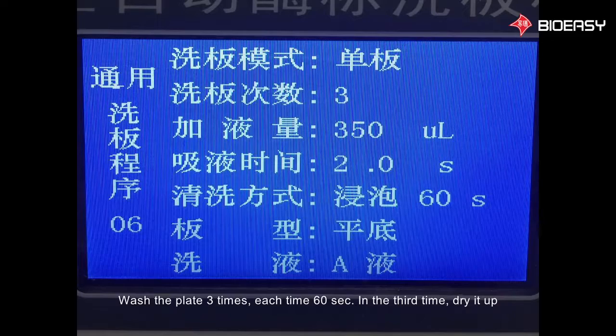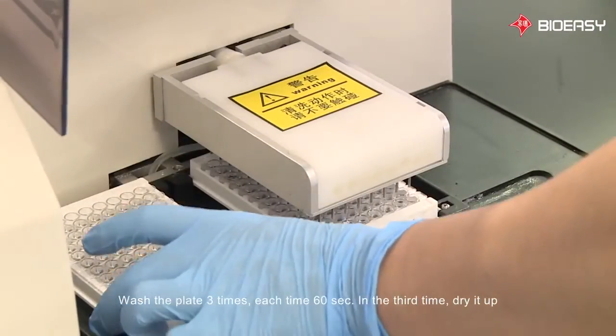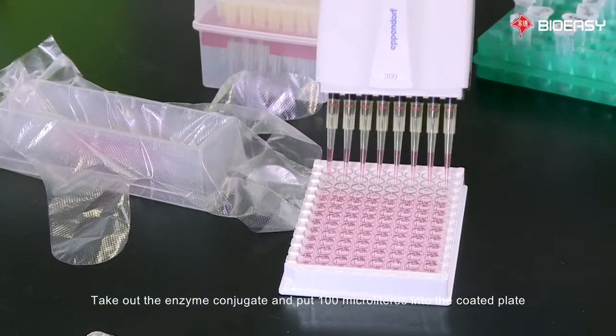Incubate for 30 minutes at 37 degrees Celsius. After incubation, wash the plate by filling the coated plate with wash solution. Wash the plate three times, each time for 60 seconds. On the third wash, dry it up. Then take out the enzyme conjugate and add 100 microliters into the coated plate.